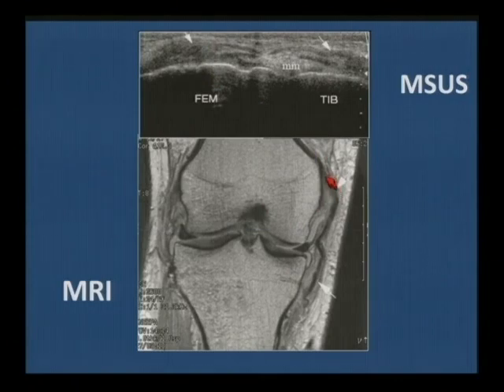And we can see that not only is the ligament swollen and irregular, but it's also redundant. See, it's sitting there waving, looking back at us, and that's because it's been avulsed, or some of it's been avulsed distally. So that's what we call a stage 3 MCL tear, which means the MCL is pretty much trashed.